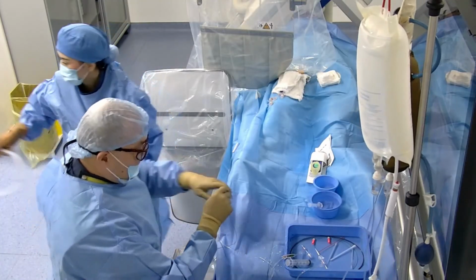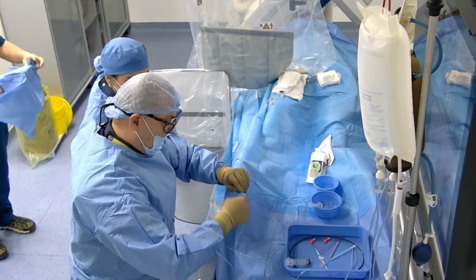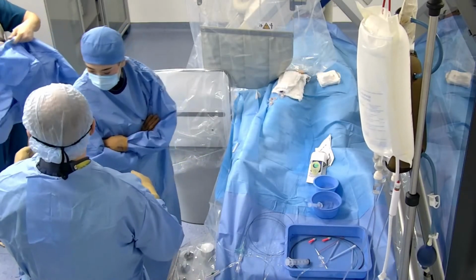And today we are working through an 8 French pilot catheter, yeah? Maksat, pilot? Yes, pilot company from the Phoenix.